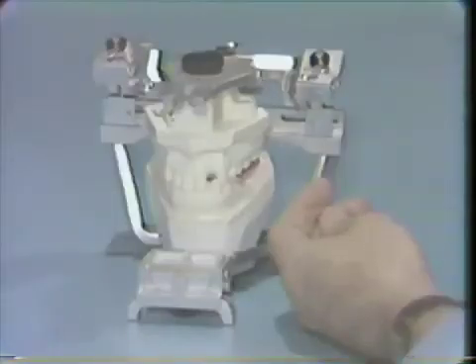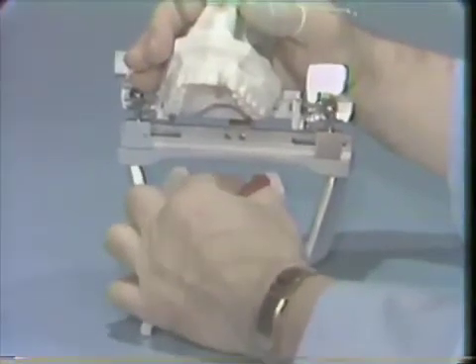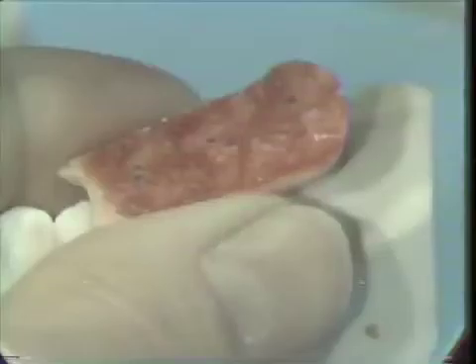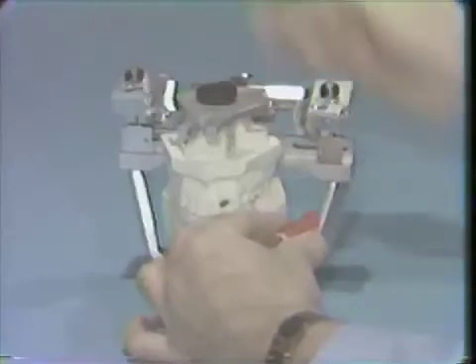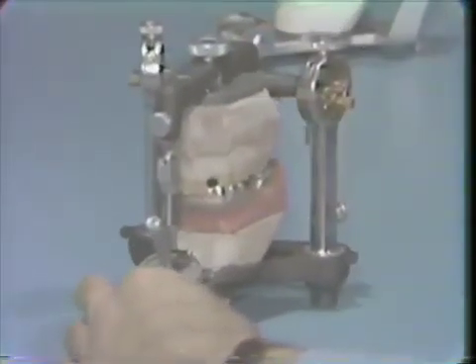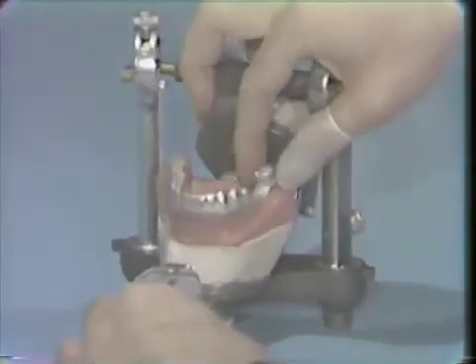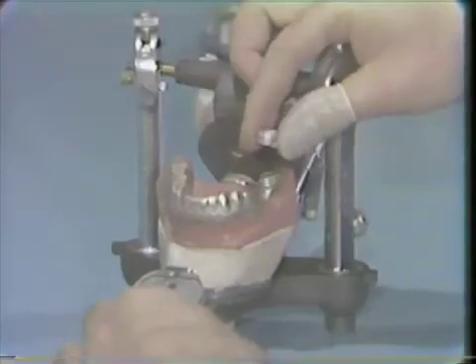So we'll now take the functionally generated wax platform from the patient's mouth, and here for this technique we did not cement it to place. So we must be very sure that our platform is stable without the cement to add to its stability. So we'll now transfer this over onto our articulator, and we have already mounted the upper anatomic cast utilizing our small bite that we generated previously with the aluminum shell crown.